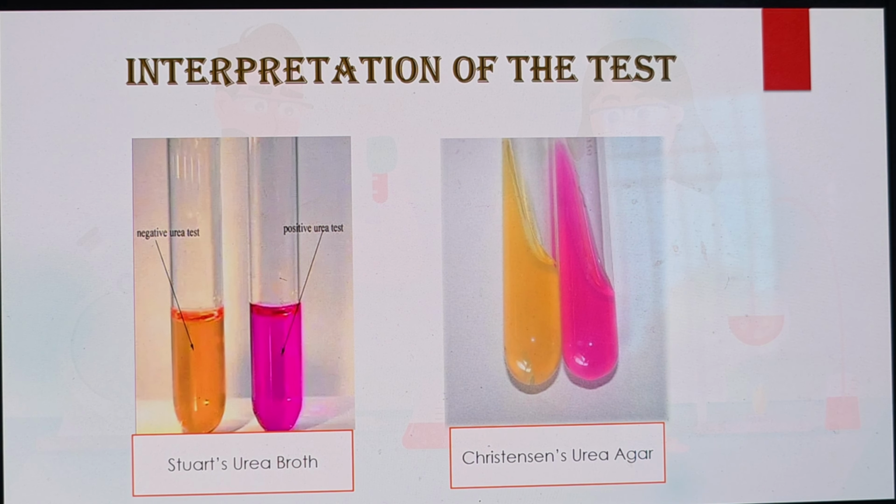Here is the interpretation of the test. If the media color changes to pink color, then it indicates positive reaction. If it remains as such or yellow in color, then it indicates negative reactions.